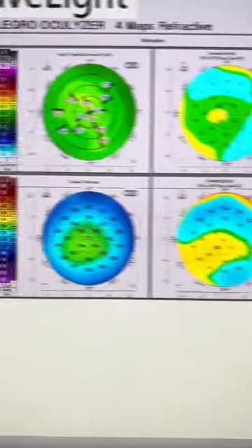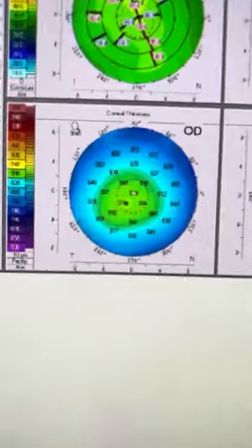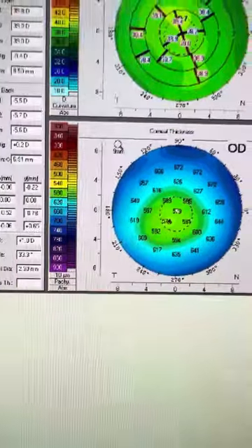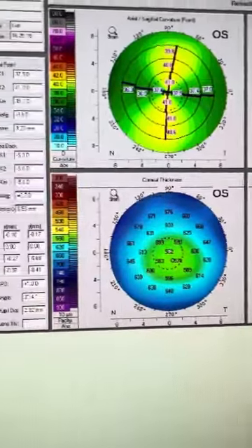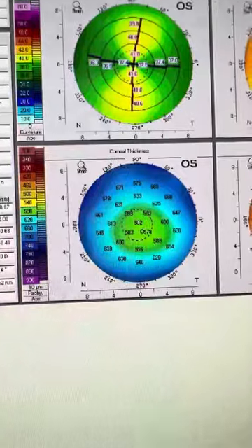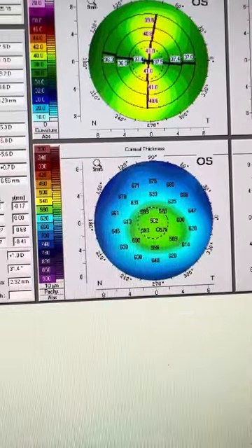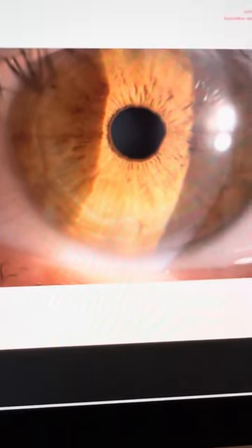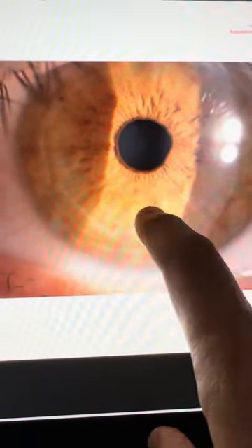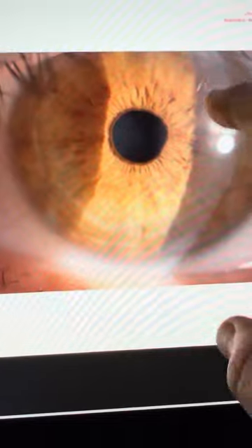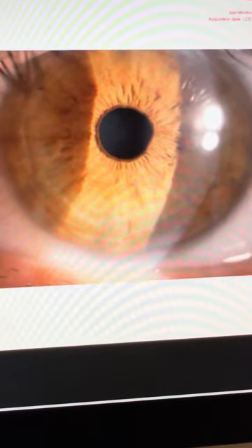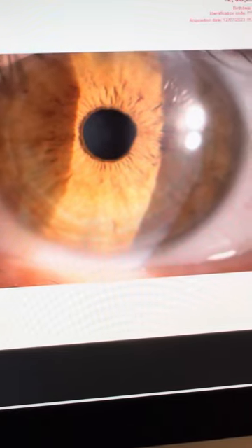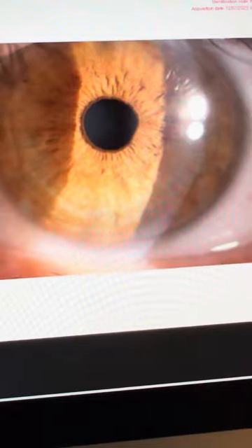Again, I'm showing the comparison of the pachymetry maps of the right eye and the left eye. And what is missing from this assessment? We test our residents all the time on this. What's missing is making sure that the eye with the high cylinder does not have any signs of Descemet split from a forceps delivery, which would be an excuse for acquired significant astigmatic reality in one eye versus the other eye.